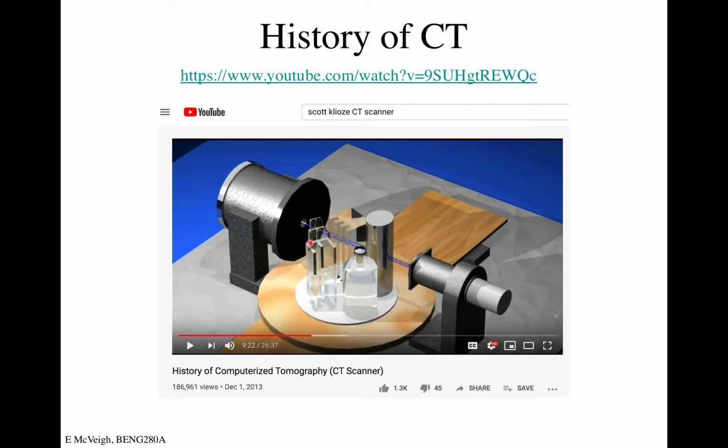So what he did was this tray of material rastered across the beam, and then he rotated the tray and then rastered it back and rotated the tray and rastered it back. And it took about 2 hours to collect everything because the amount of radiation coming out of here wasn't very high. So you had to pause and collect data for a little while.